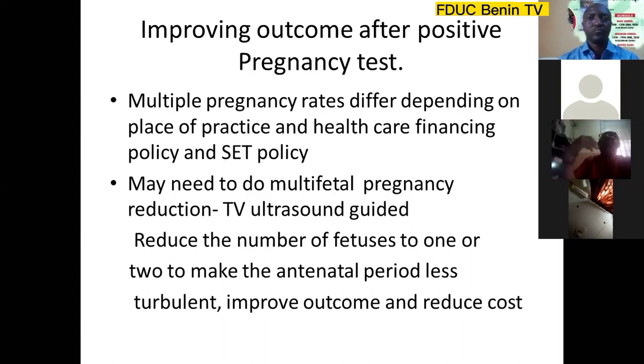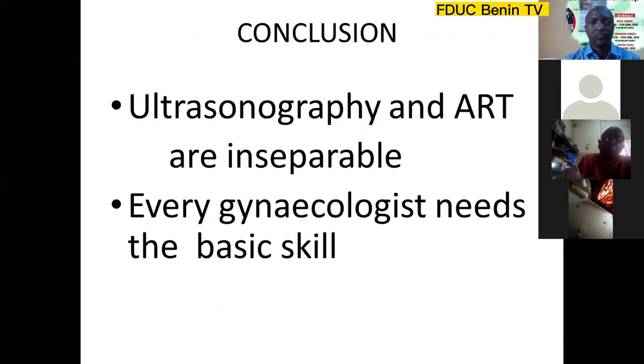But when you do sonohysterography, it gives you a better picture and even detects things like endometrial polyps and what have you. Now, in ovarian assessment, you use your scan to determine the ovarian reserve. The best technique is not the volume; yes, ovarian volume is okay, but the best measurement is the antral follicle count. That gives you the best idea, and it correlates with what you get from anti-Mullerian hormone assessment. And then you use your ultrasound to monitor follicular development.